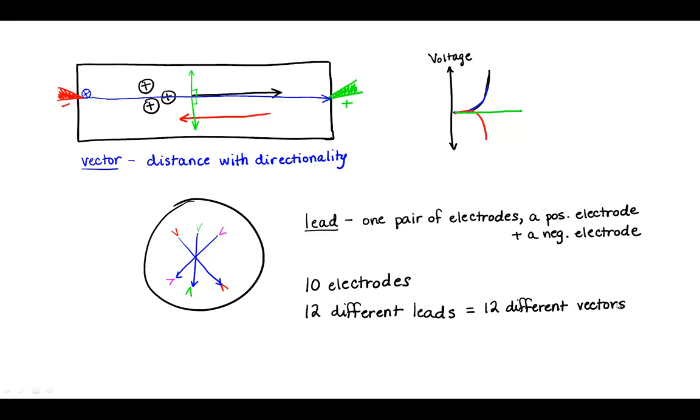And so then all an EKG tracing is a readout of how well different charge motion vectors, or directions of charge moving around inside of the heart, align to each of the different leads. So that is the general idea of how EKGs work.